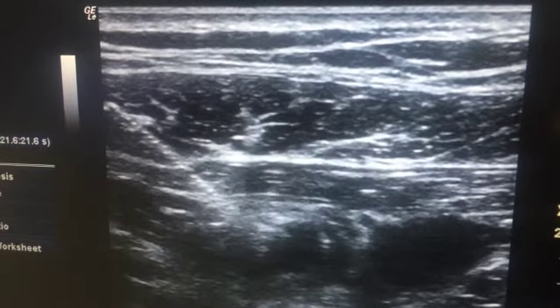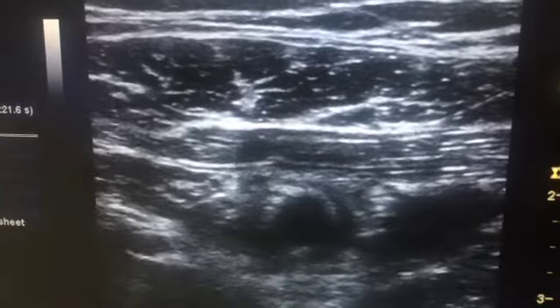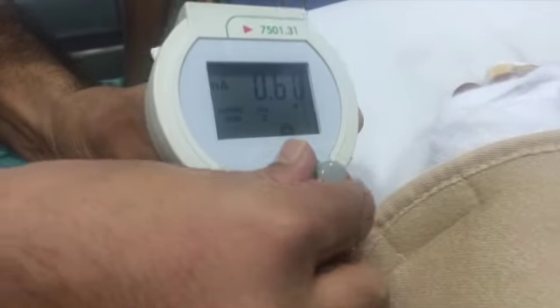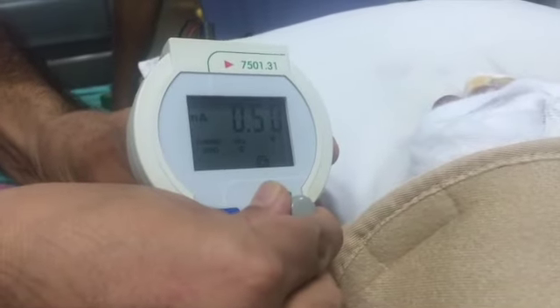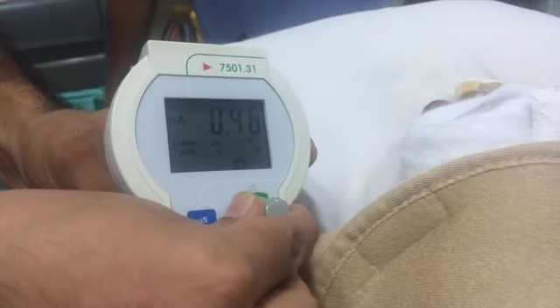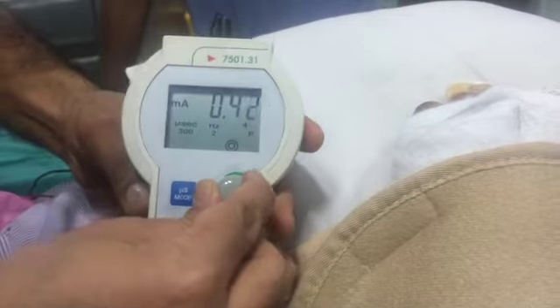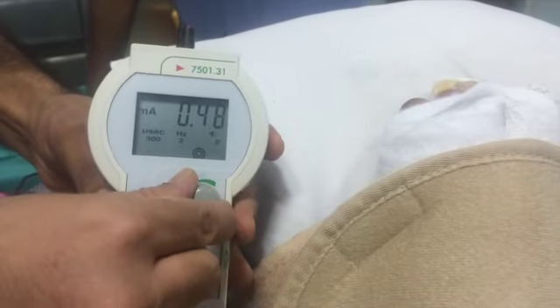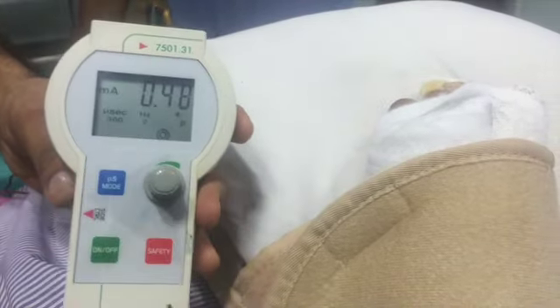This is the response of the lateral cord — you can see the stimulation here at 0.6. I am reducing the current; at 0.4 it disappears, so I will take it at 0.5 where it is nicely seen.